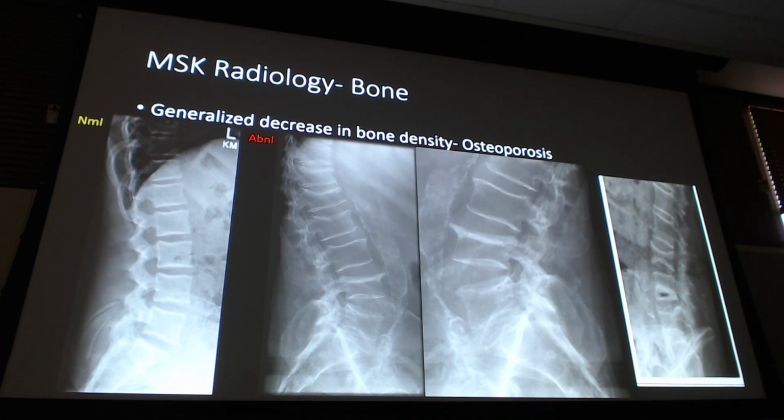I'm confused with your question. Like when you're looking at the spine versus the foot. Yeah, so okay. Do not compare spine x-rays with foot x-rays. They're different techniques, they're different amounts of radiation, right? I don't want you to get confused, right? I don't want you to get too messed up, like, well, how come the foot looks like this and the spine? I want you to compare normal spine with abnormal spine and normal foot with abnormal foot.